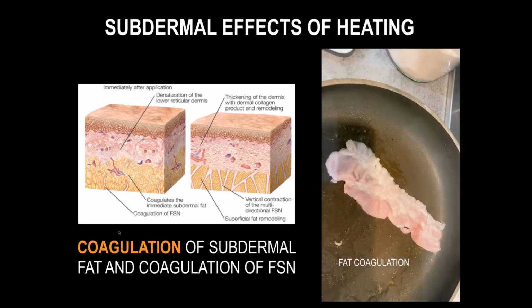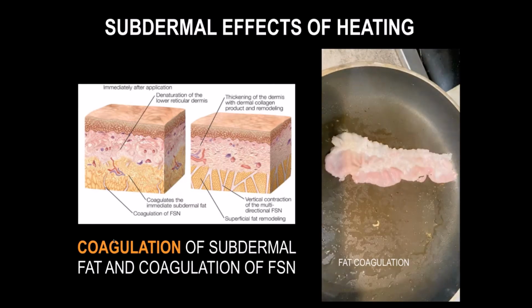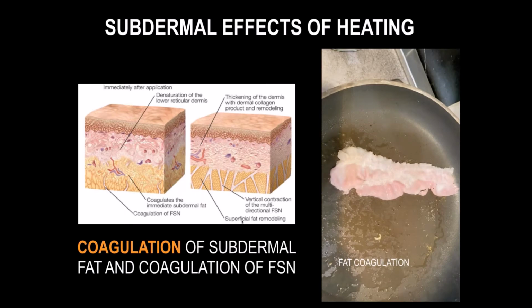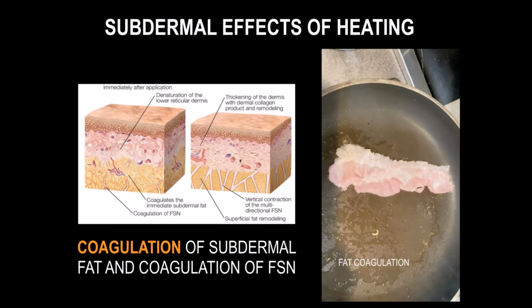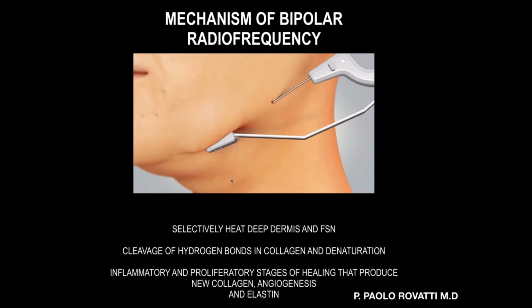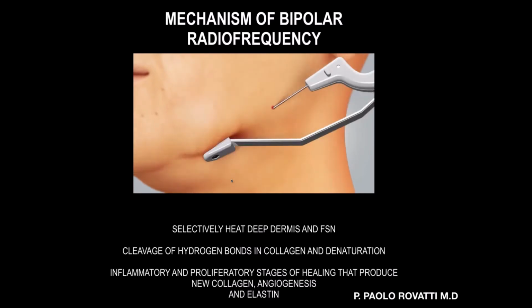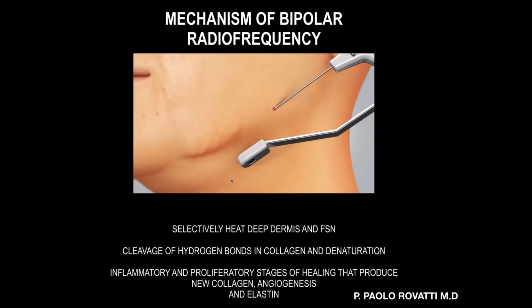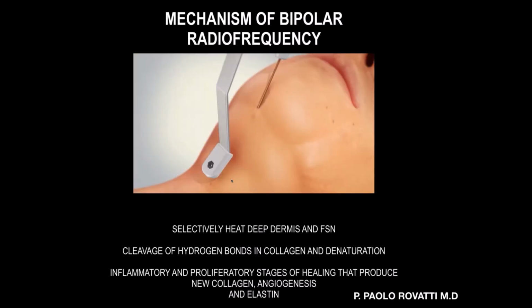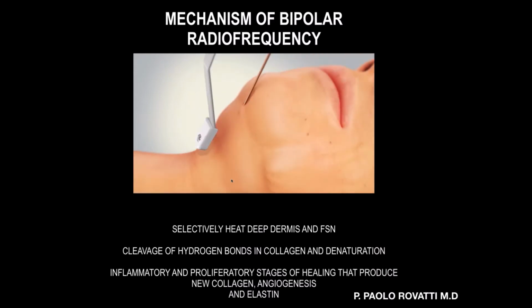So the coagulation of subdermal fat and the coagulation of fibrous septa network, this is what happened in our body, in the subcutaneous tissue and in the septa. The mechanism of bipolar is very easy to understand because it selectively hits deep dermis and fibrous septa network, because there is a cleavage of hydrogen bonds in collagen, and there is a denaturation. And this produces new collagen, angiogenesis, and elastin. So this is good for our tissue.